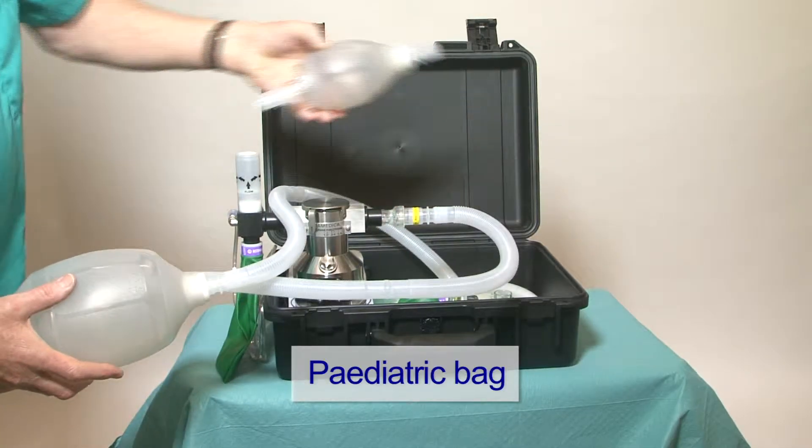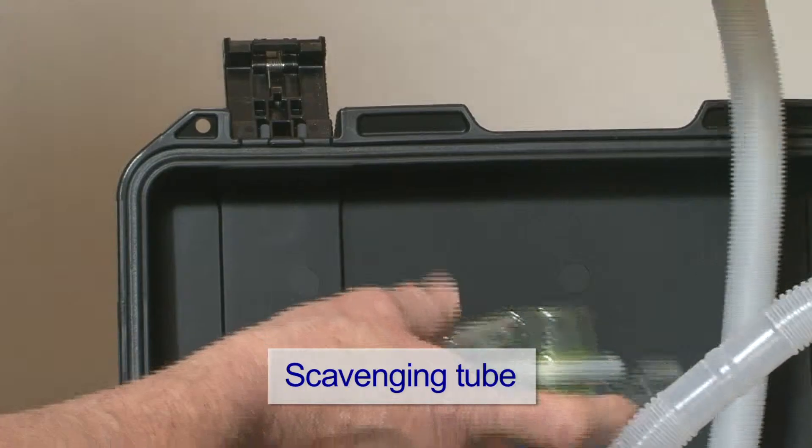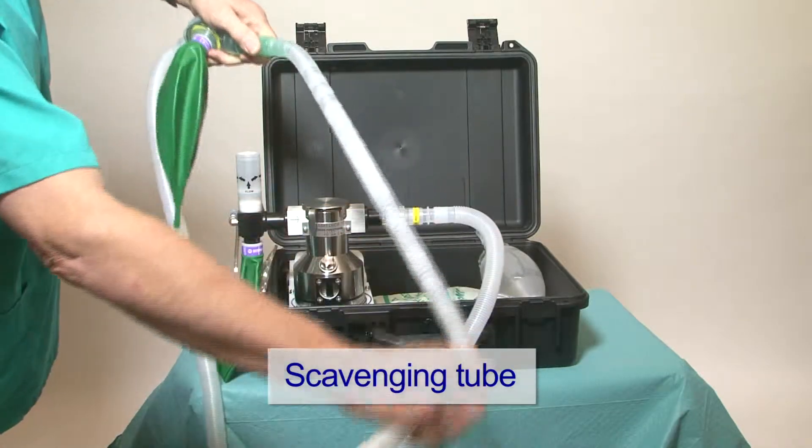The pediatric bag can be attached instead of the adult bag when required. Scavenging can be connected to the expiratory side of the patient valve.